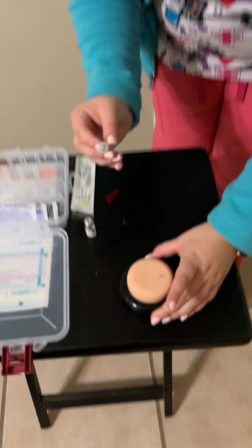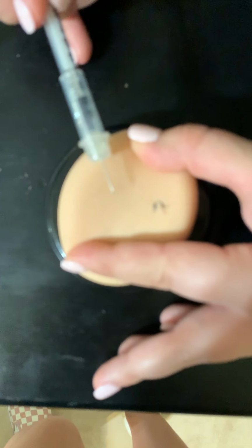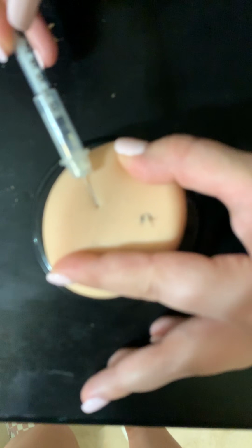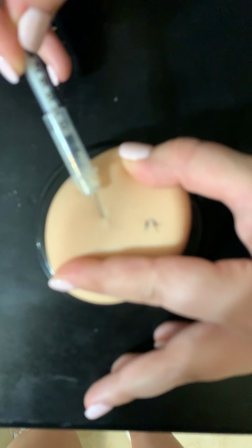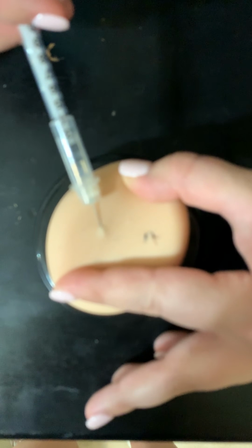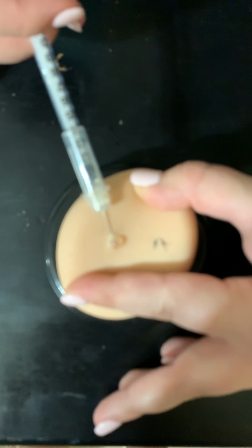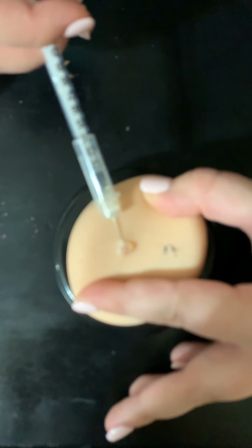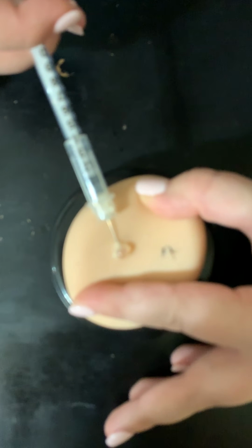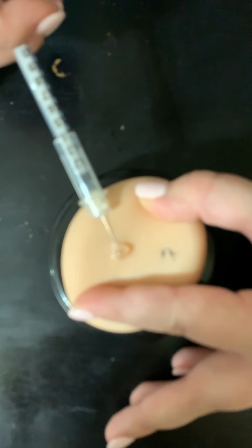So, like I said, we're going to taut our skin. We're going to go in at a 10 to 15 degree angle. We're going to go in just enough at the top layer of the skin. We're going to push the plunger and administer the solution. Now, a wheal should end up popping up like so. That is normal. That is good.